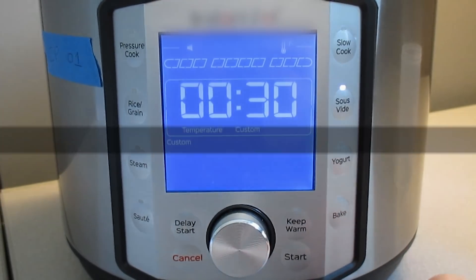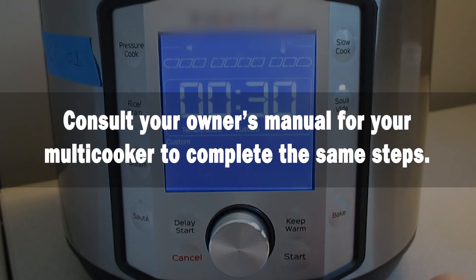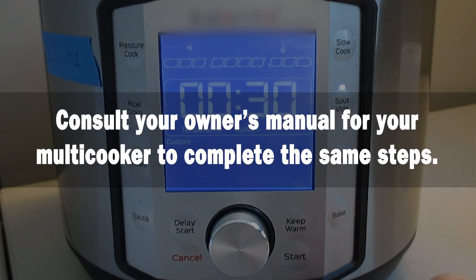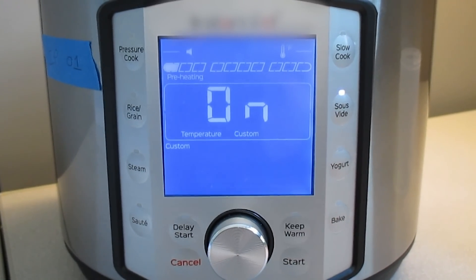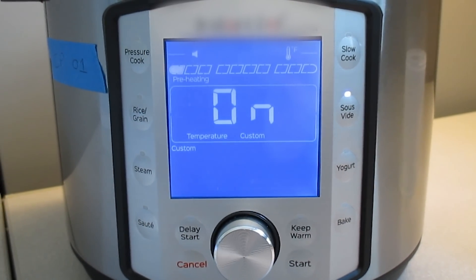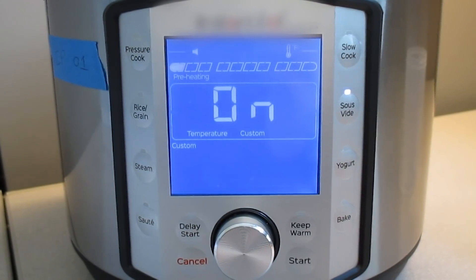Then press start. Please consult your owner's manual for your multi-cooker to complete the same steps. Press start and confirm that the cycle has started. Once it is running, leave the multi-cooker to complete the cycle.